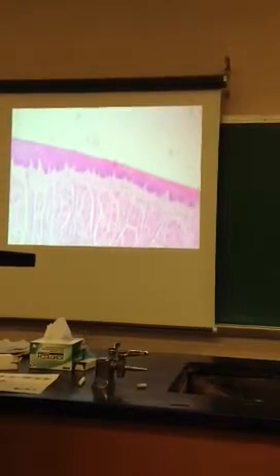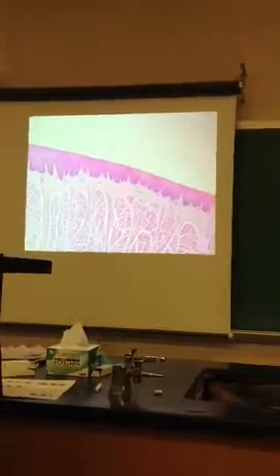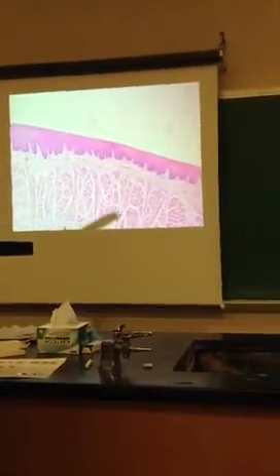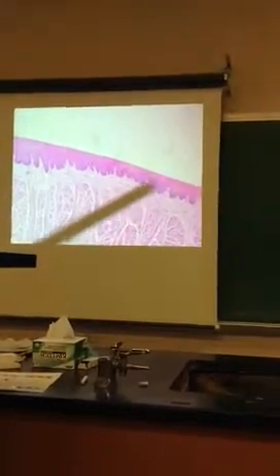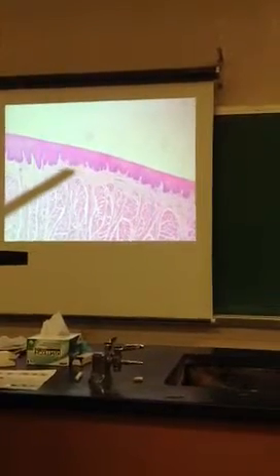What is it? Tongue. Okay, so the slide over there was asking what all this bottom part was. That was the skeletal muscle. All of this layer is lamina propria. The projections, stratified squamous. Oh no, projections are the filiform papilla.